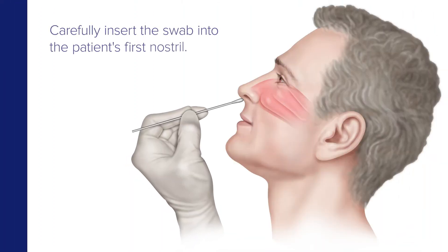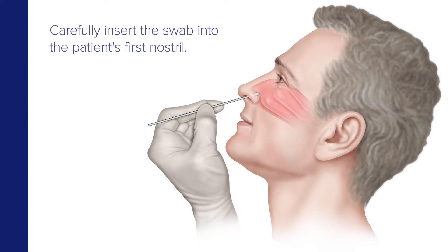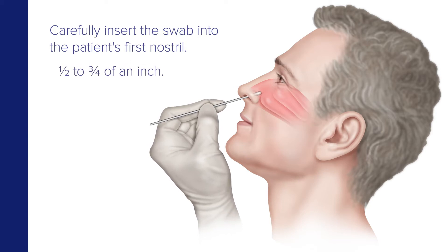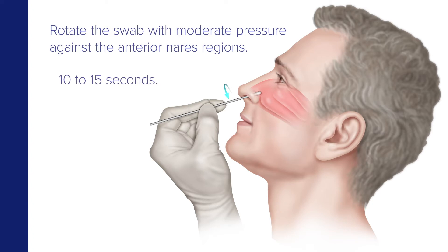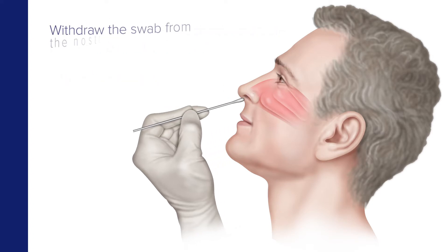Carefully insert the swab into the patient's first nostril until resistance is met at the turbinates. This is half to three quarters of an inch into the nostril. Next, rotate the swab with moderate pressure against as much of the wall of the anterior nares region as possible in a large circular path at least four times, which is about 10 to 15 seconds, and withdraw the swab from the nostril.